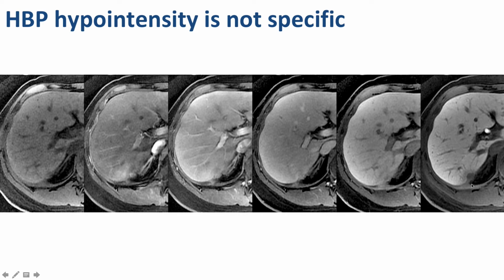Now, the point of this case is not, there's another little story. We submitted this as a case report because I thought it was pretty cool or interesting that we got fooled by a piece of vegetable matter against the liver, and they rejected it. And the comment from the referee was, any good radiologist would have known that this was not a hepatic lesion. And so I couldn't really respond to that, because they had just basically said I'm not a good radiologist, and so I didn't really know what to do. So we never published it.